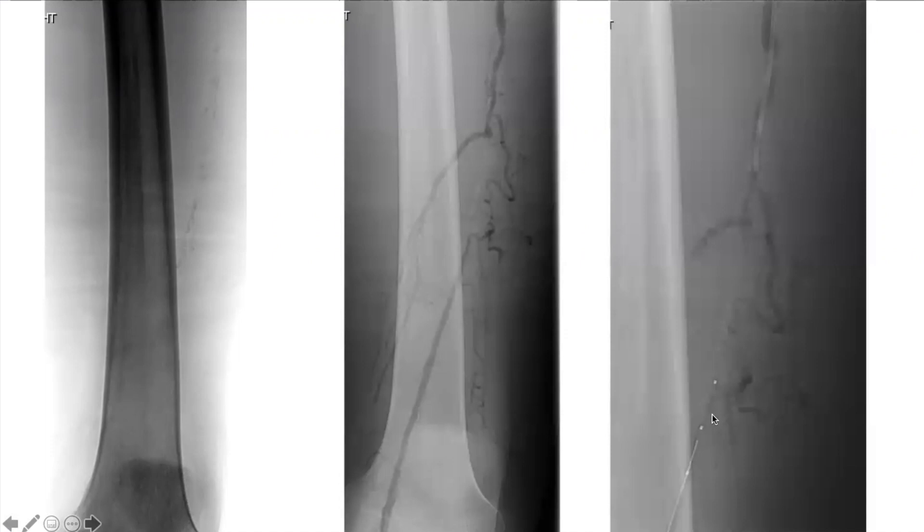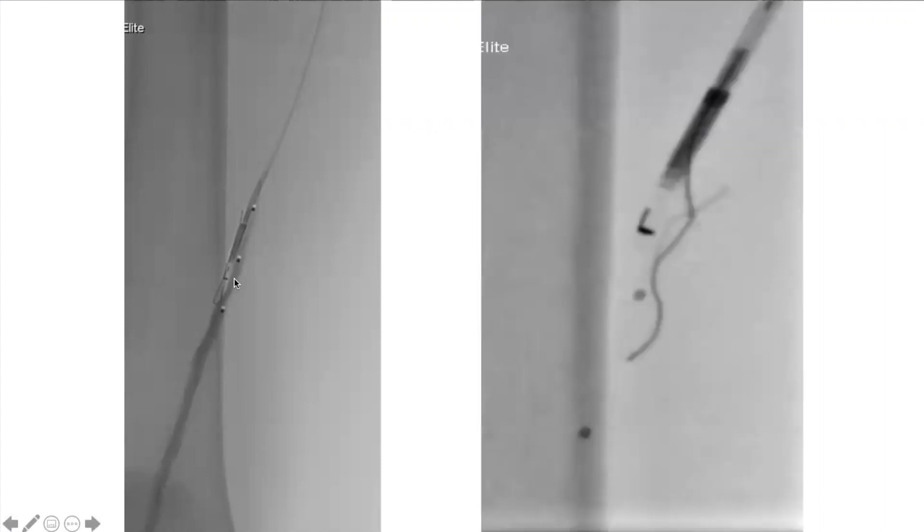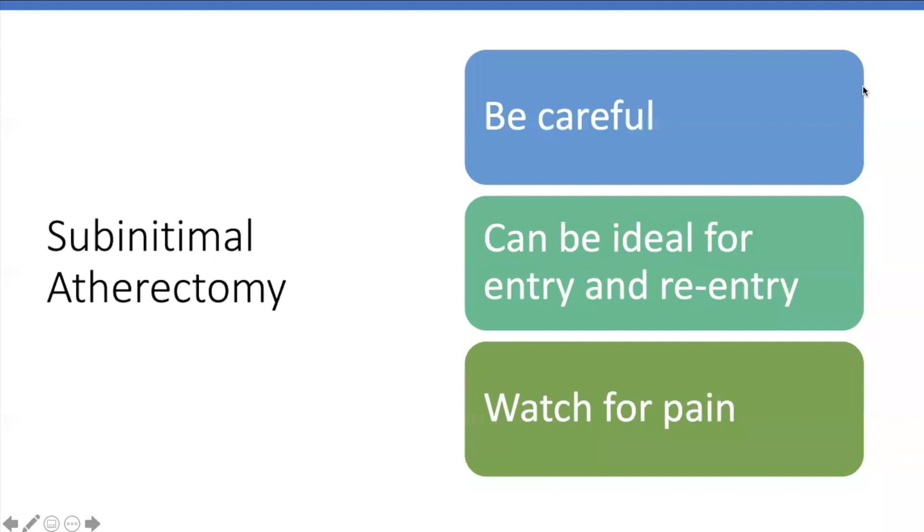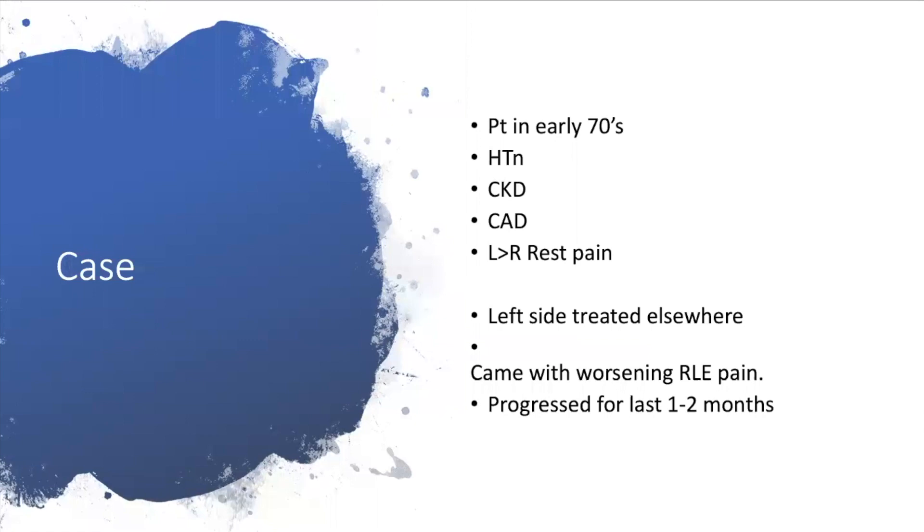This patient has diffuse areas of calcium and an SFA occlusion with distal reconstitution. We tried from above and couldn't cross, then came from below with an 0.018 system — still couldn't cross. We used an Outback re-entry device and a micro snare from below with a microcatheter — a 4mm micro snare — pulling the wire all the way down. I then used Hawk directional atherectomy across the subintimal calcified space to get better luminal expansion. The caliber was good so we placed a stent scaffold.